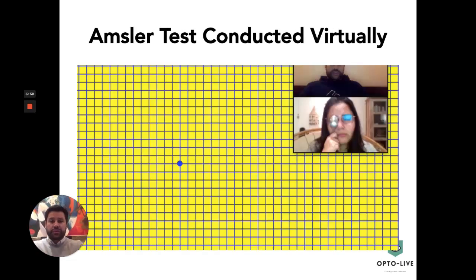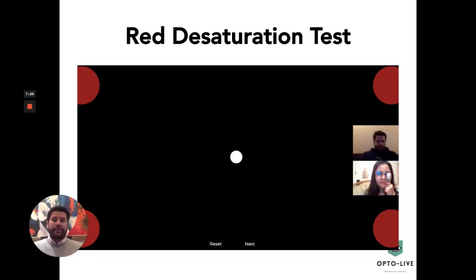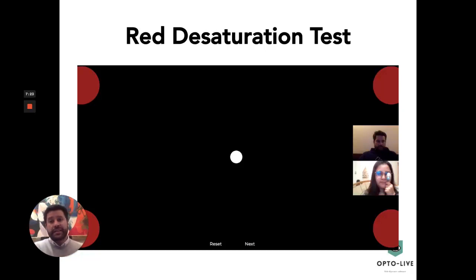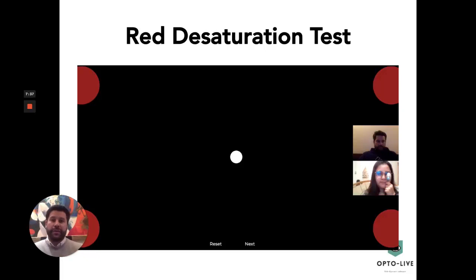The Amsler screen becomes full screen so that when the patient is looking, we ask them to occlude as a normal Amsler test is done and focus on the central point. Any defect is recorded in the software. The next test we can conduct is a red desaturation test, where we can assess all four quadrants of the retina. We can also increase the intensity on each quadrant to record how much intensity needs to be increased in which quadrant to assess which area of the retina may be compromised.